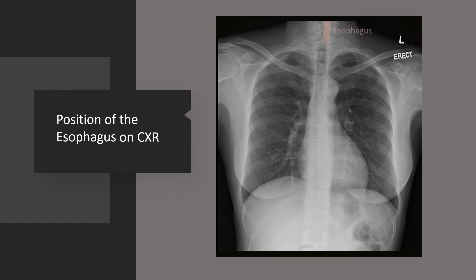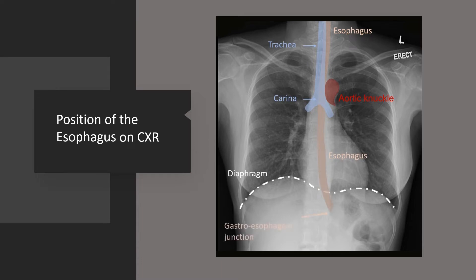Typically, the esophagus passes vertically over and slightly to the left of the trachea. The esophagus is then positioned adjacent and immediately to the right of the aortic knuckle. The esophagus then passes vertically down in the midline below the diaphragm and past the gastroesophageal junction into the stomach.